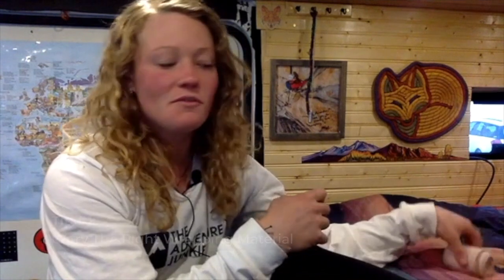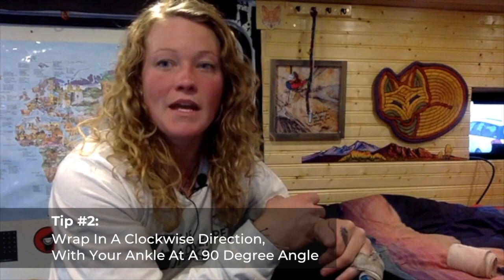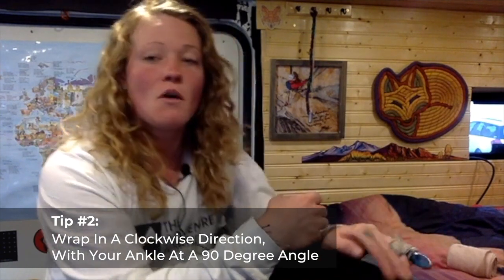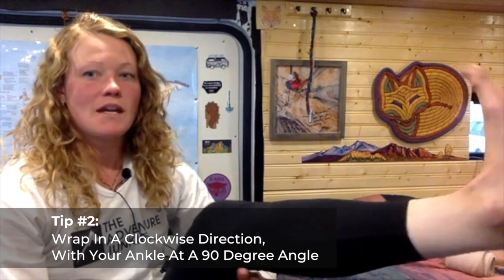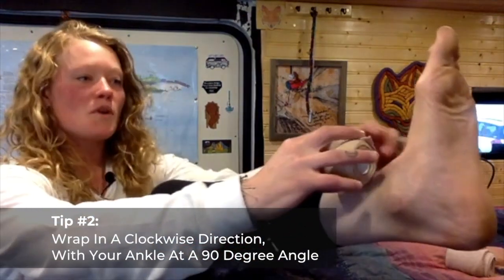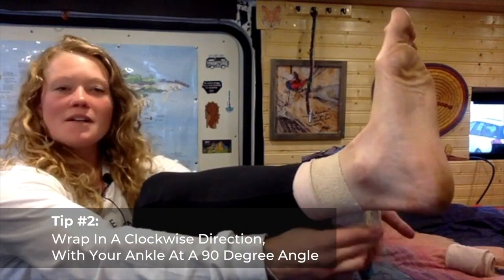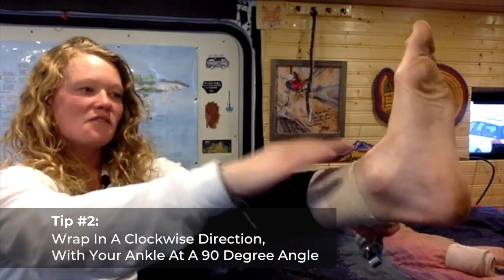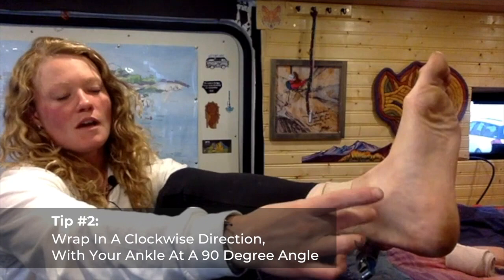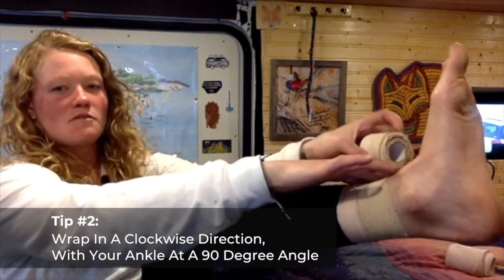Tip number two: you want to ensure that you prepare to wrap the ankle in a clockwise direction while holding your ankle positioned at about a 90 degree angle. The first wrap you want to go around the top of your ankle to make a base for you, about two inches above the base of your foot, and you want to make sure you do that clockwise.